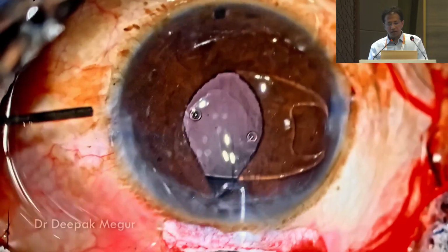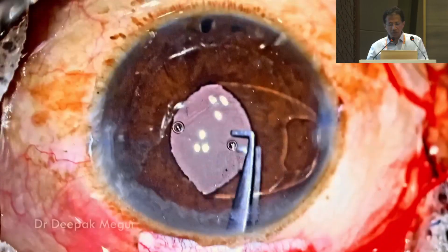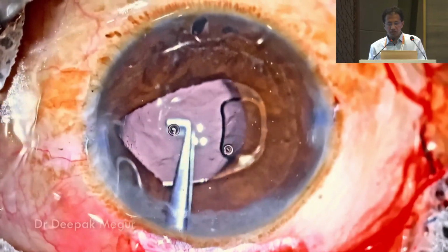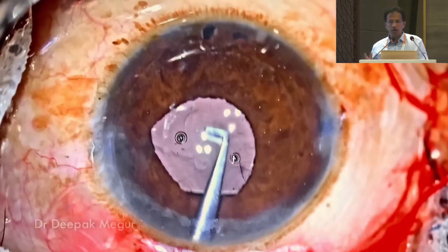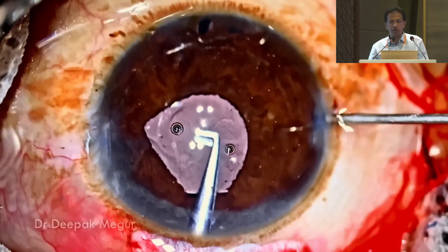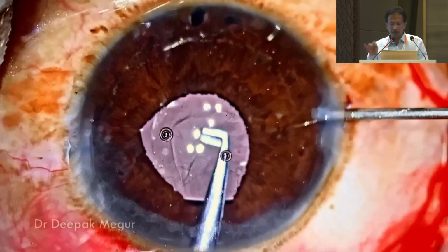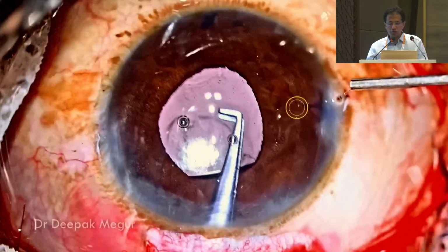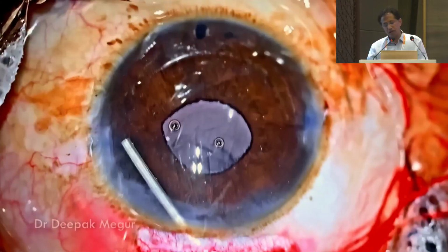So again, the eye chamber is refilled with OVD. Again, the instruments are switched. Again, the position of the forceps is such that it is in alignment with the notch which is there. The haptic goes underneath the iris, and then we are going to use this 26G cannula again to nudge the iris there, so that you can see the knuckle developing. That ensures that the iris is very safely enclaved.